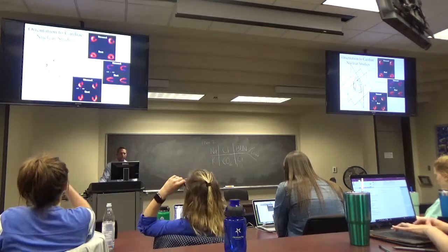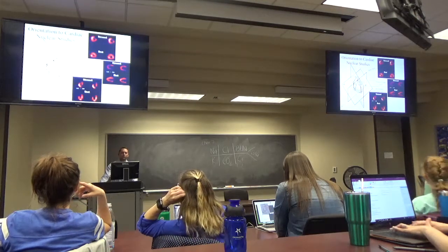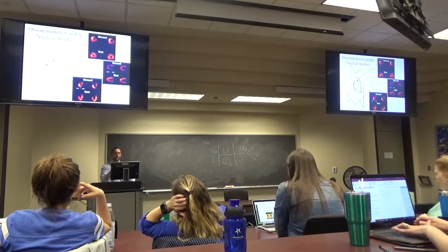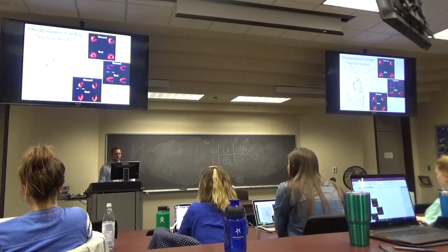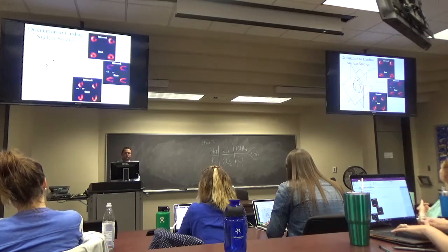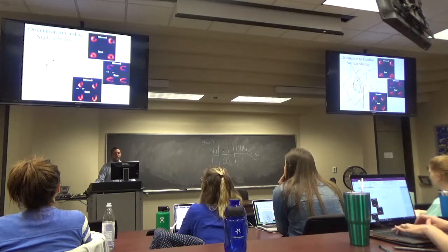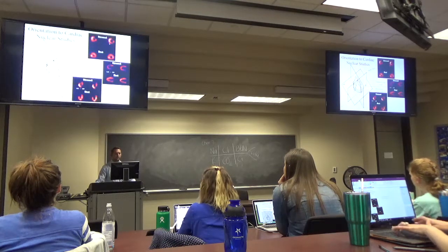So I wanted to give you guys a little orientation. This is actually a thallium scan. I want you to pay attention to the short axis, which is the top one. All of these are renderings of the left ventricle, okay? That's the thing you're most concerned about in a nuclear study. You want to know the function of the left ventricle. On the anterior side of the left ventricle and 2/3 the way down the anterior septum is the LAD distribution. The lateral distribution is the circumflex, and then the posterior 1/3 and the posterior of the heart is the right coronary artery, or PDA territory.